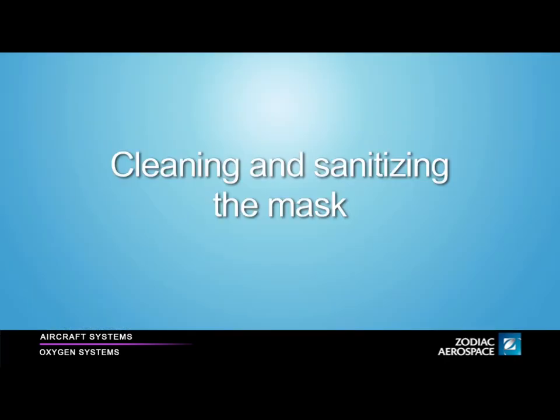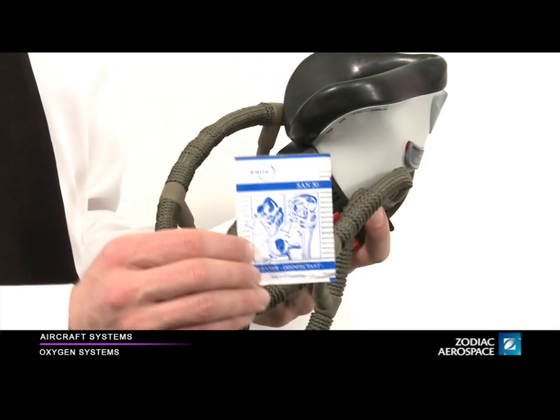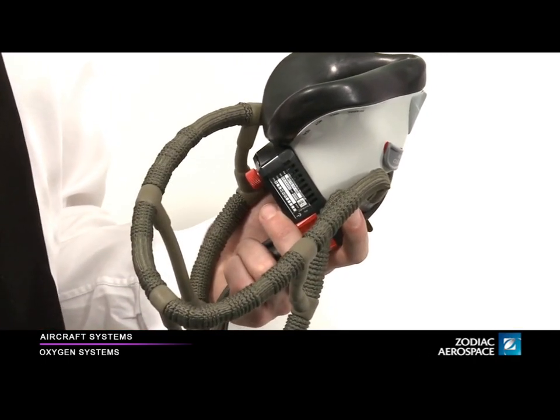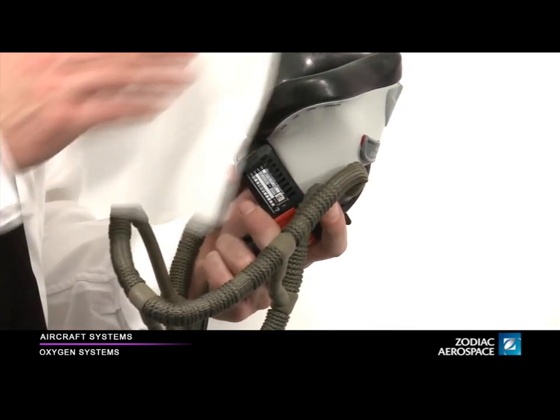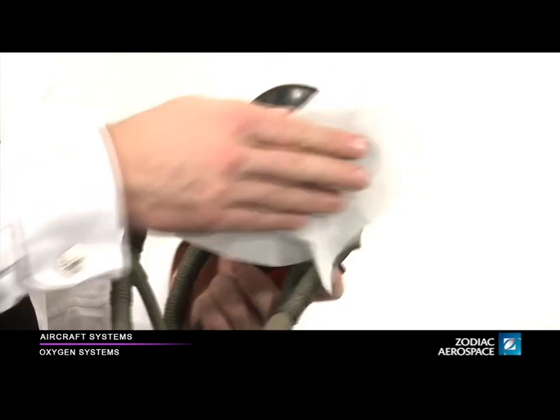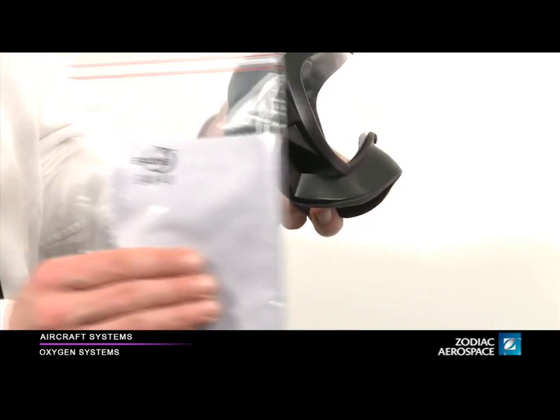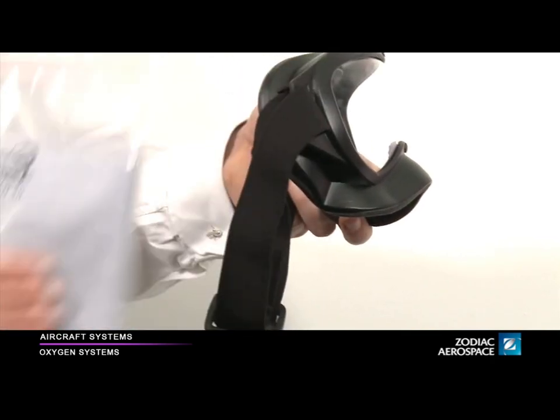Cleaning and sanitizing the mask. Use the Eros San 50 wipe to clean and disinfect the facial seals. Use the Eros San 40 cloth to clean the goggle lens.